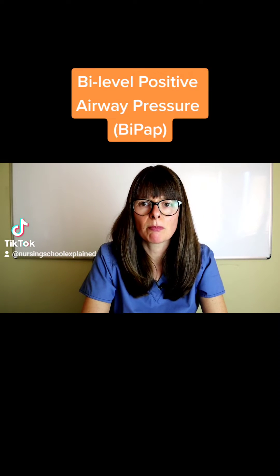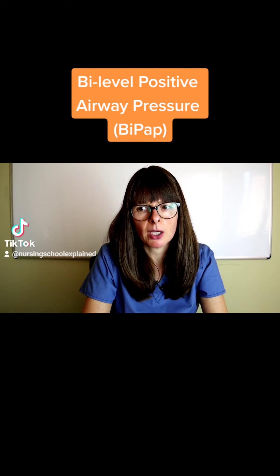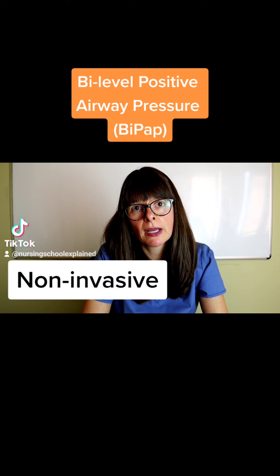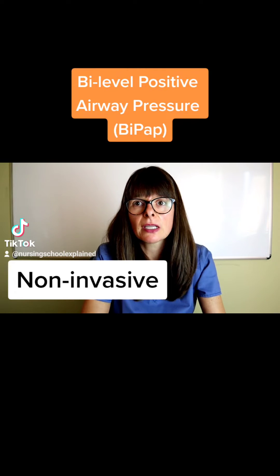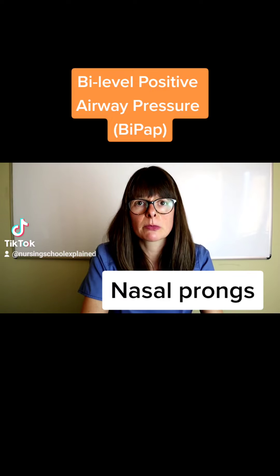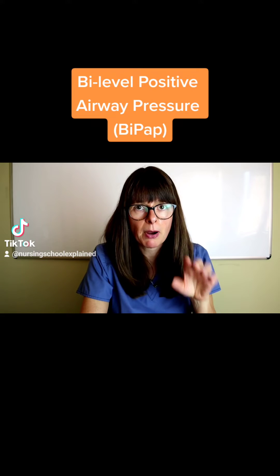A BiPAP machine, or bi-level positive airway pressure, is a non-invasive aid to help the patient breathe better for whatever reason. It is non-invasive, meaning there is no endotracheal tube attached, but it uses a tight-fitting face mask or nasal prong where the machine creates positive pressure.